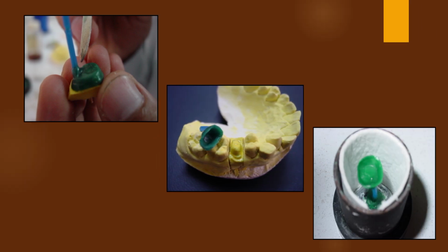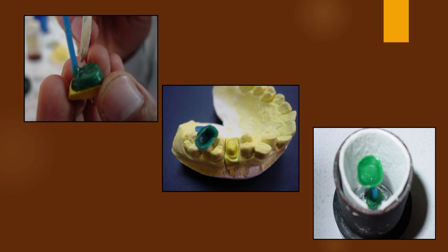Once the wax has been burnt, the investment is left with a hollow replica of the wax pattern. The sprue is attached to the wax pattern. The diameter and the length of the sprue depend largely on the size and type of the pattern, the type of the casting machine to be used, and dimensions of the ring. The sprue is at the point of the greatest bulk of the pattern, that is the largest sectional area of the pattern, in order to avoid problems of distortion of thin patterns.